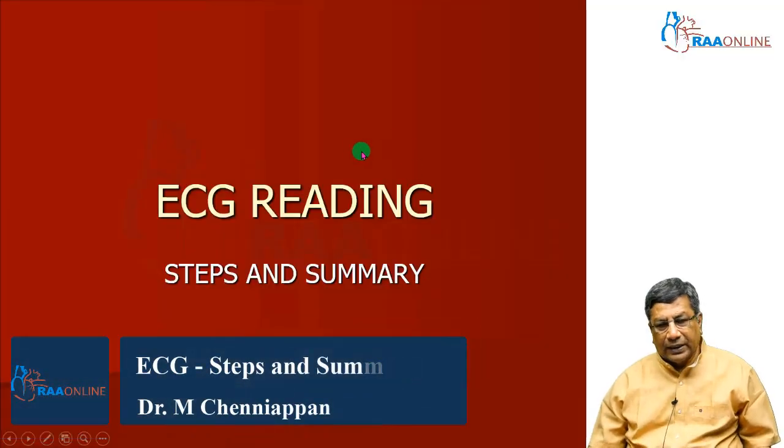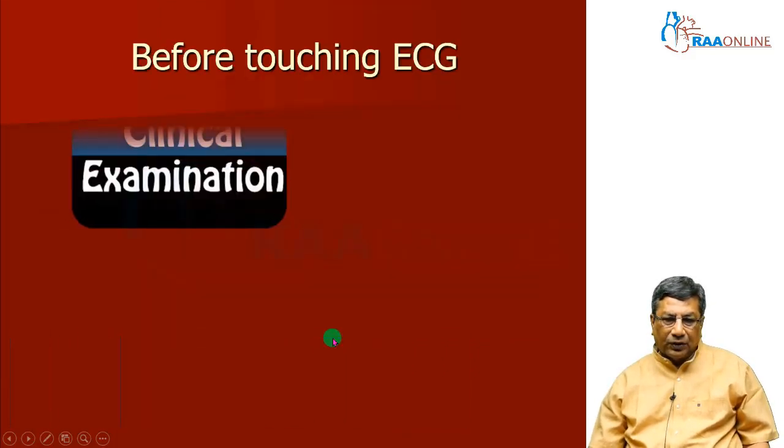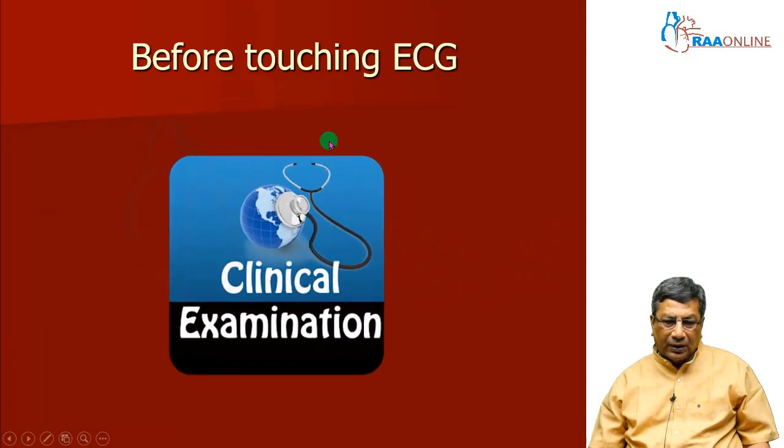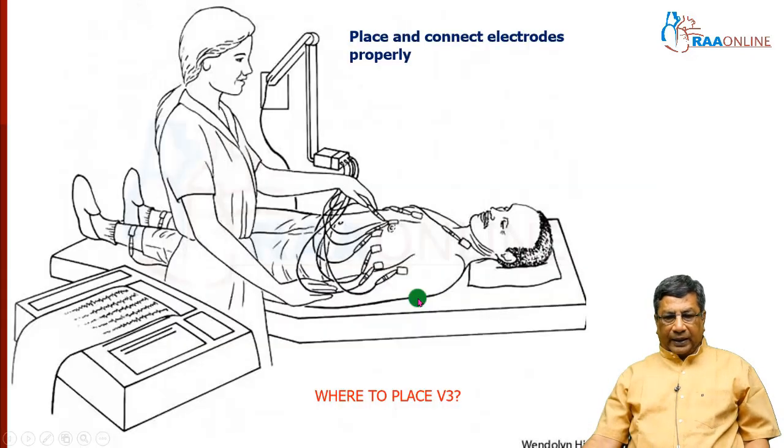So, having finished the entire ECG course, I will go through the steps and summary of ECG reading. Before touching the ECG, please remember you have to clinically examine the patient, so we have good clinical data before we record an electrocardiogram.